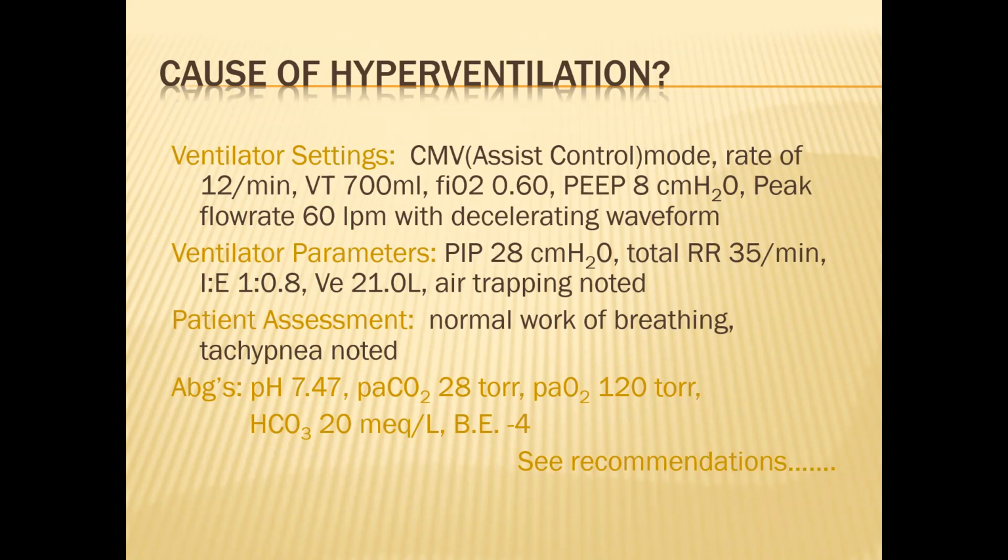I've had doctors, patients in assist control, breathing 35 times a minute. They're breathing too fast, turn the set rate down to 8 per minute. Doctor, that's not going to help. I said, turn it down. So I turn it down. Of course, the patient continues to breathe 35 times a minute. So it doesn't make a difference. In SIMV, it does, but not in full support.